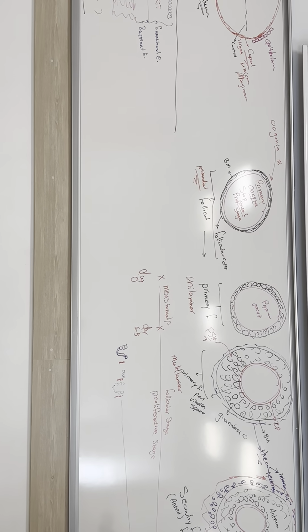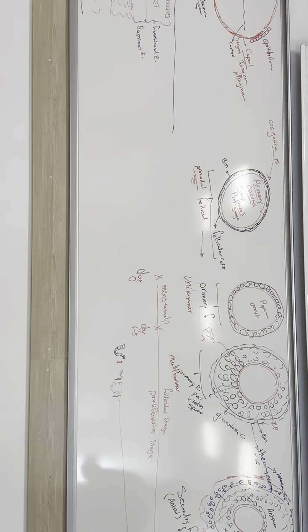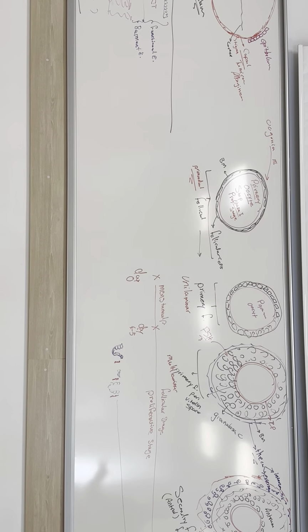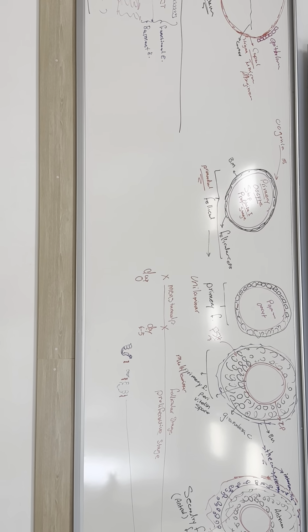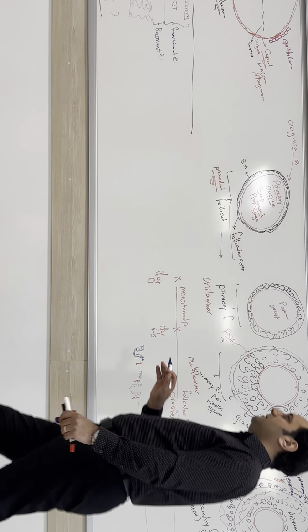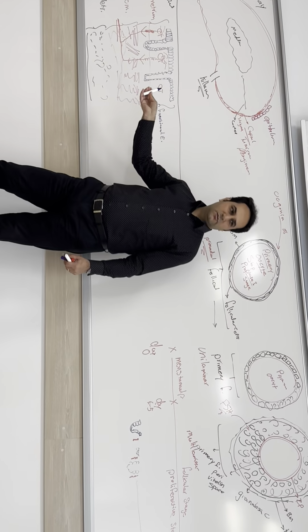With this stage, the thickness of endometrium returns to its original size, and glands and connective tissue again form their normal structure.